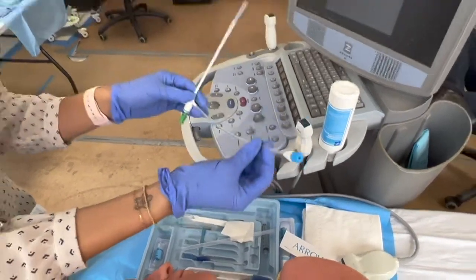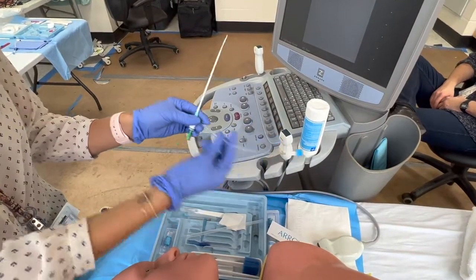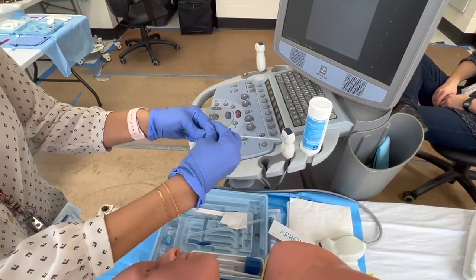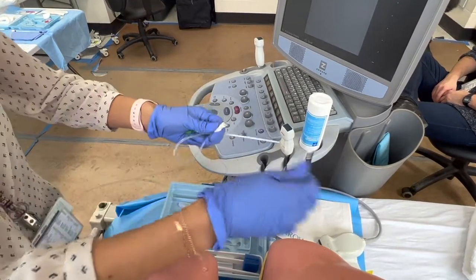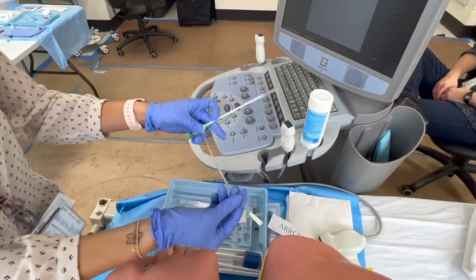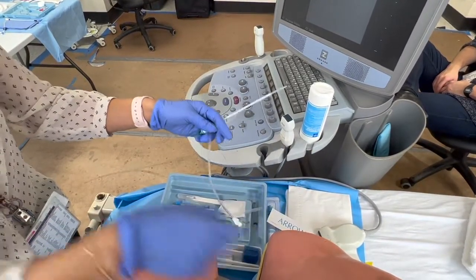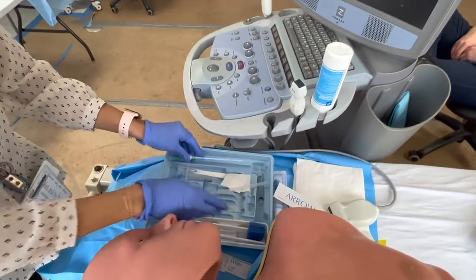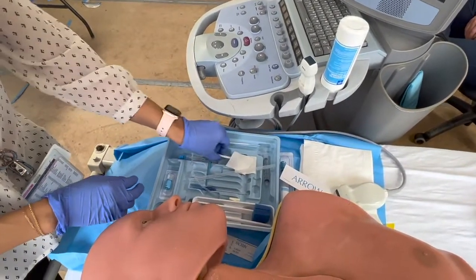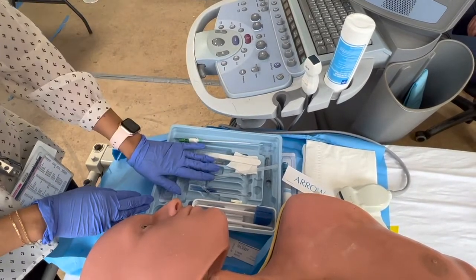On the larger cordis kit, there's actually something you can click on here to stop blood flow — this one does not have one. You can just take this off and flush it if you remember to, or if this is a crash situation, you're just going to wait till you get blood all the way back and then flush the whole thing. For now we'll keep it off. You have your scalpel, and your wire ready to go too — and that's it for setup.